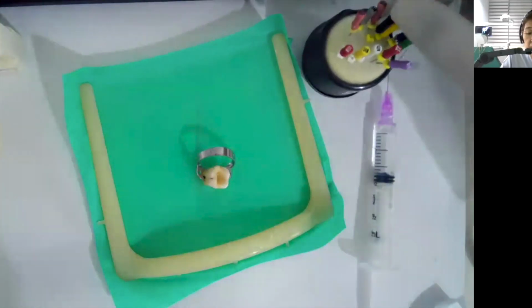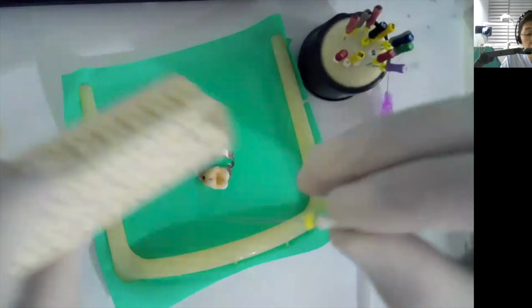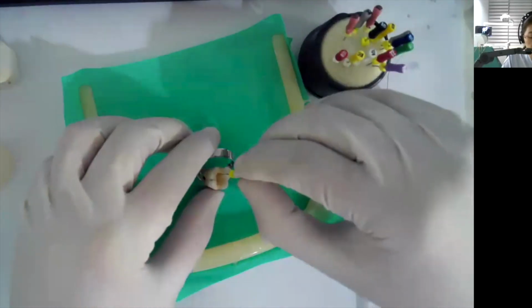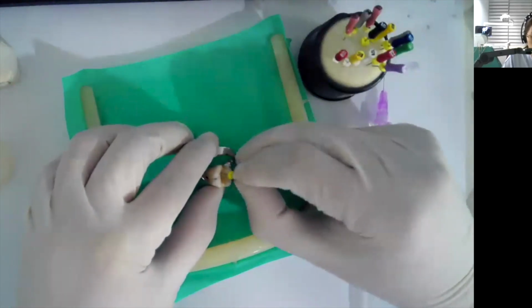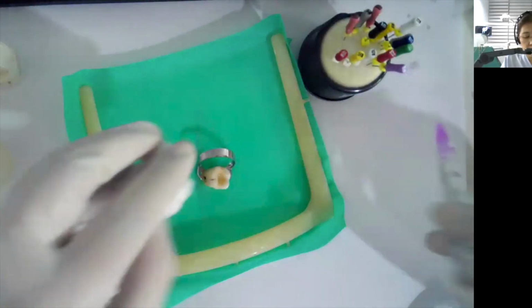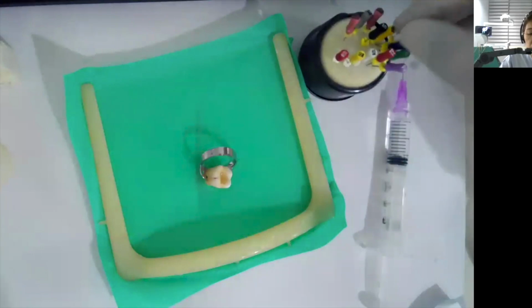And then I'll be starting with 15, still at 22.5, and put some EDTA. So you do the watch wind technique again. And then irrigate. And then I'll go now to size 20.